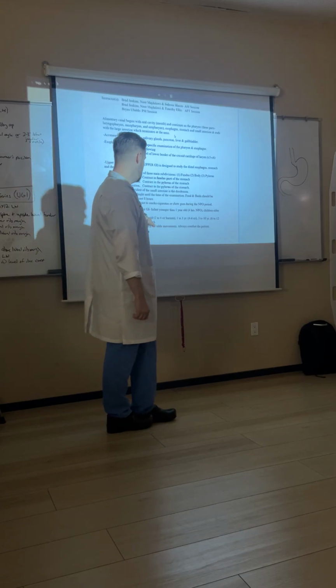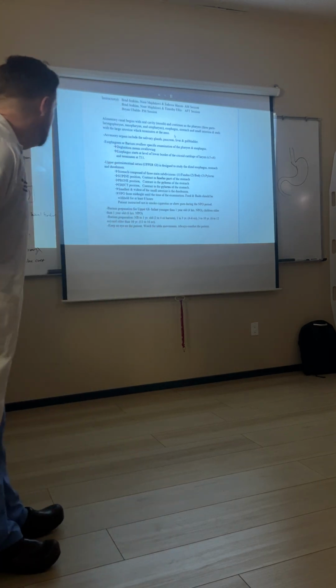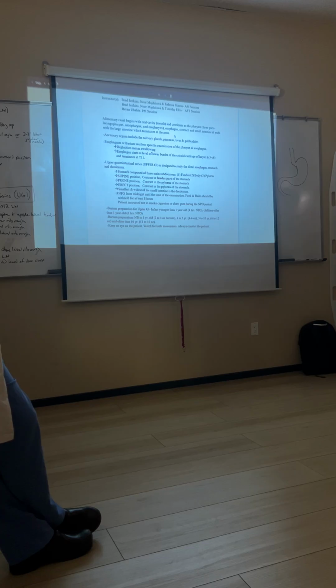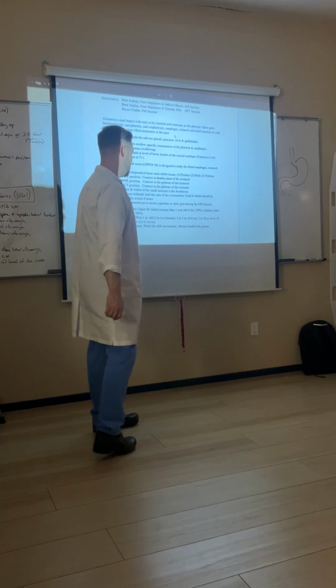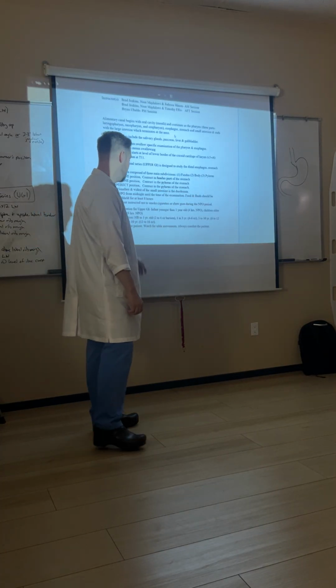Barium preparation, newborns to 1 year old, they're going to get 2 to 4 ounces of barium. 1 to 3, 4 to 6, 3 to 10, 6 to 12, and older than 10, 12 to 16. This is a very nice little line of information that will go right out of your head once you leave this room, because the barium amount is going to take what it takes, right? But for our purposes, for your test especially, I'll try to make sure you know those different amounts, okay?